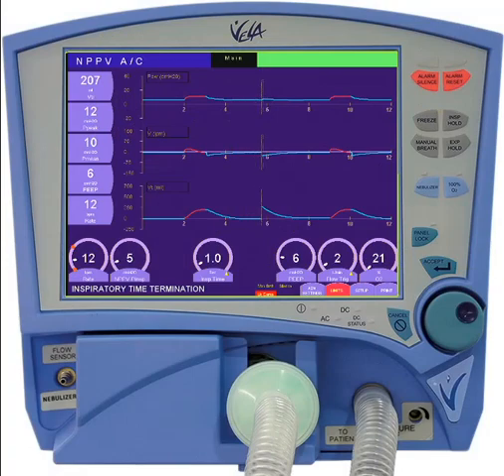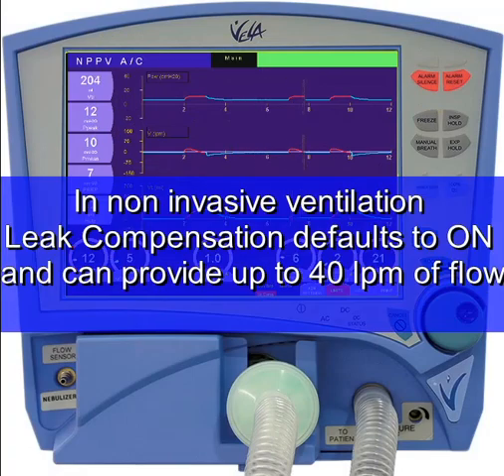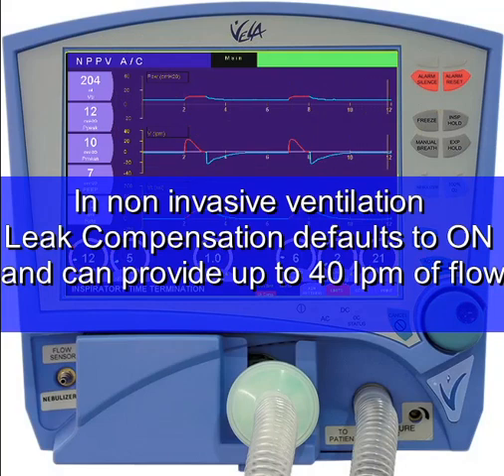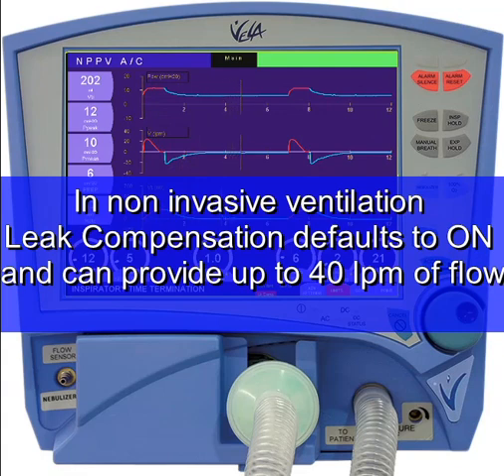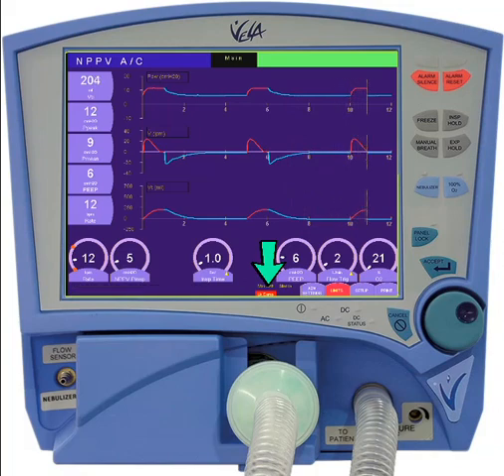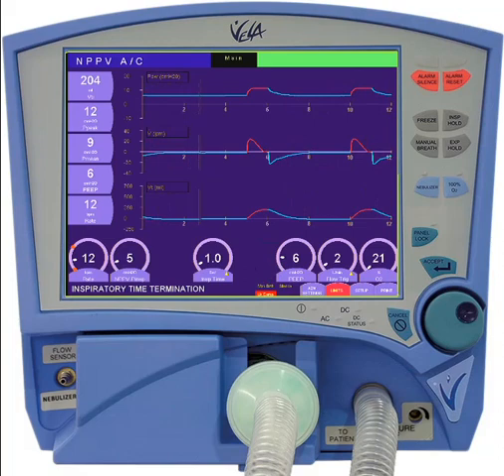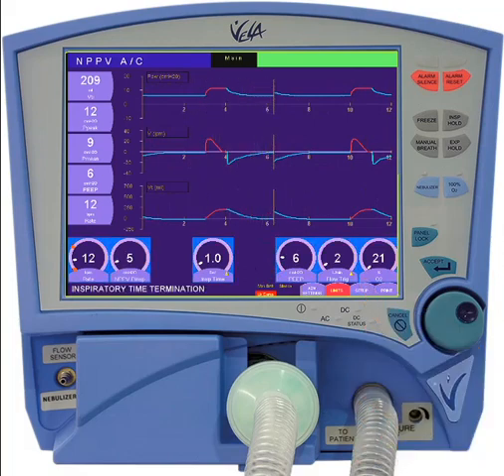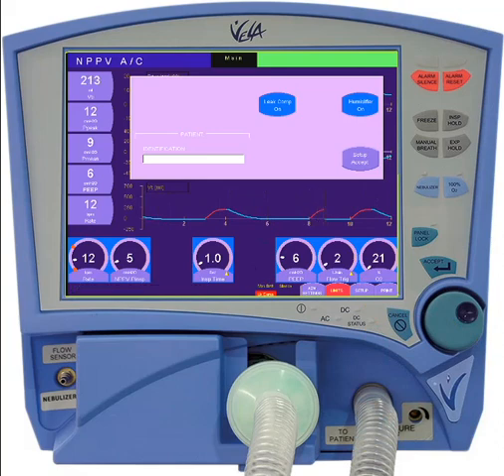When operated in the non-invasive modes, Vela features 40 liters per minute of leak compensation, which defaults to the on position. When leak compensation is active, it can be recognized by the small red icon located at the bottom of the display. To access the leak compensation switch, you must open the setup menu. The button can be found in the lower right-hand corner of the display. Leak compensation is also available in invasive ventilation.